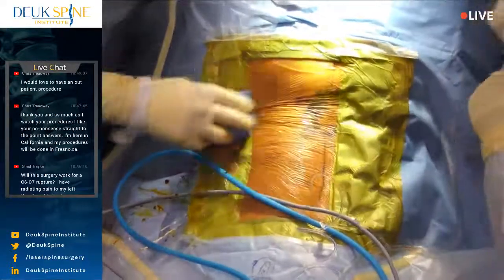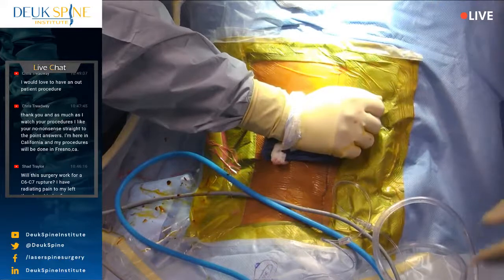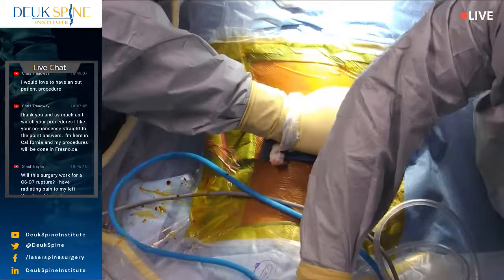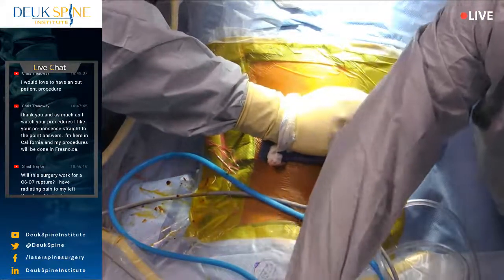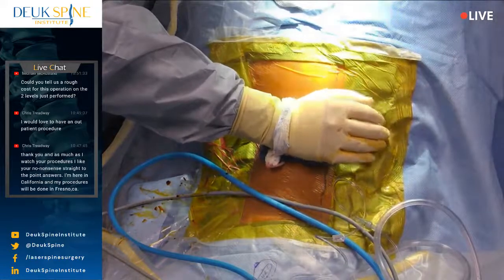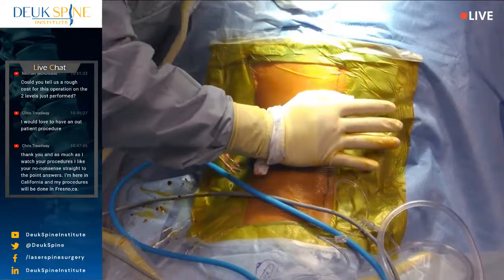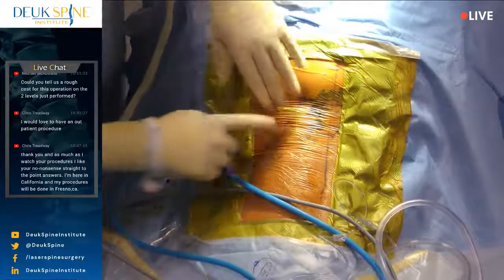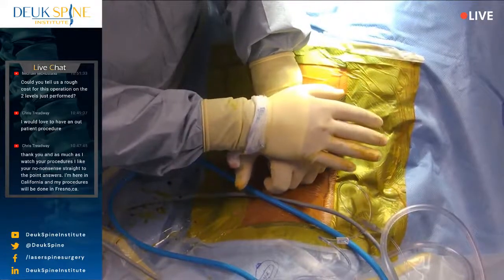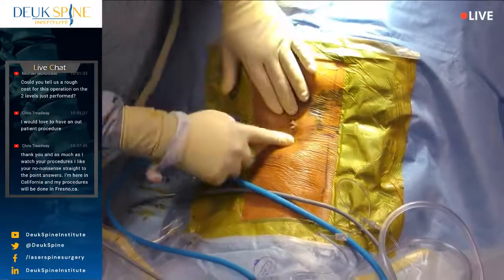If this was an open surgery, it would be a lot more blood loss. Most spine surgeons lose about 300 to 500 milliliters of blood per level they fuse or laminectomize. And if you think about 500 milliliters of blood loss for one level of open surgery, that's basically just under 10% of your blood volume, maybe a little bit more, 12%. That's one of the reasons most surgeons stop at one level. If they do two levels, they're going to lose 20% of the blood volume. Then you're going to have to transfuse, because you're going to get symptomatic once you lose more than 20%.